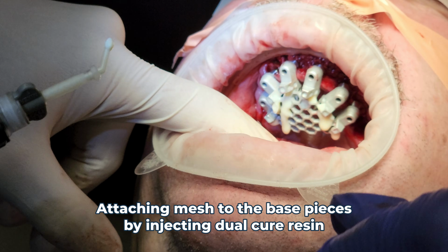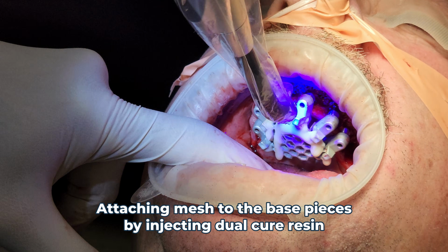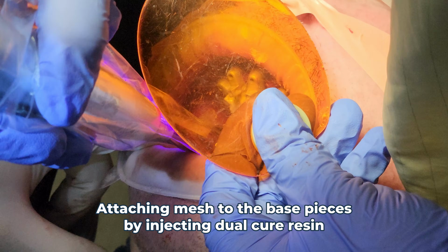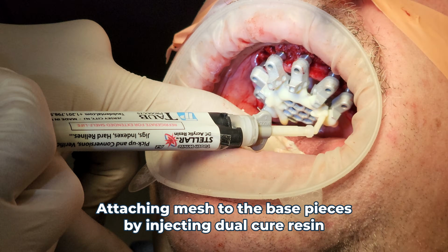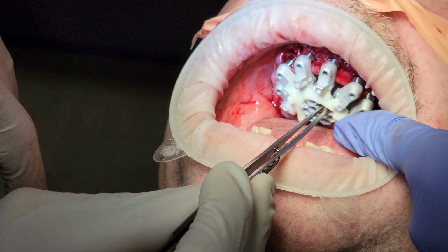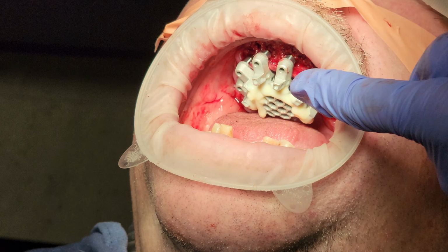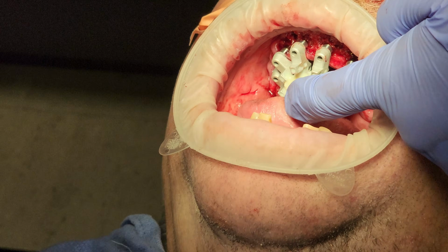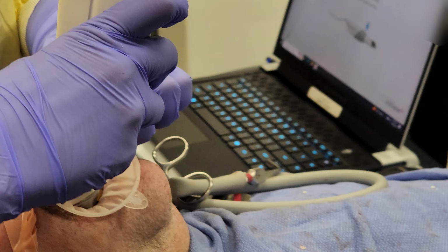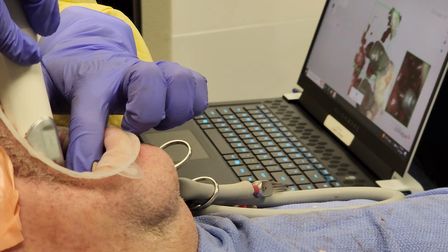So now, once we have that OptiSplint firmly set and splinted together, we can scan the OptiSplint, the mouth, and the tracers that we put in place at the beginning. Because we are scanning the tracers with the OptiSplint in place and before with the teeth still in place, we know exactly where the implants are in connection with all the previous records, including the digital scans and CT scan that we took before. And that's how we continue to line everything up.